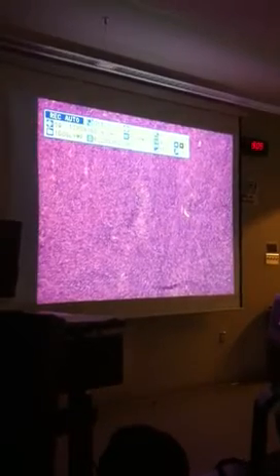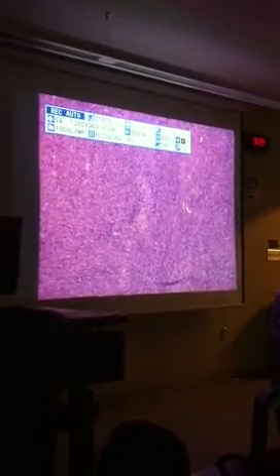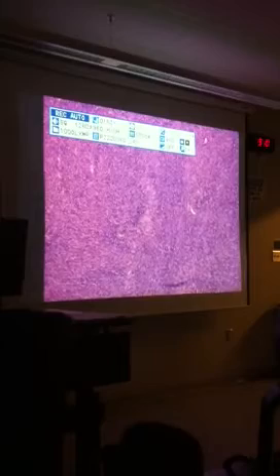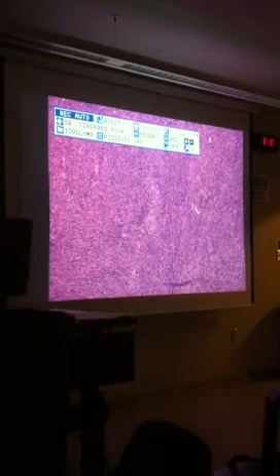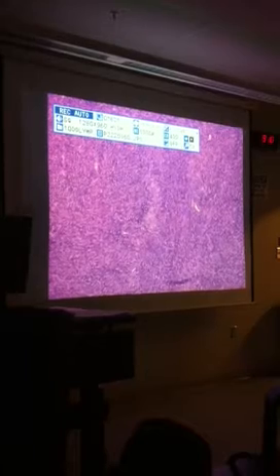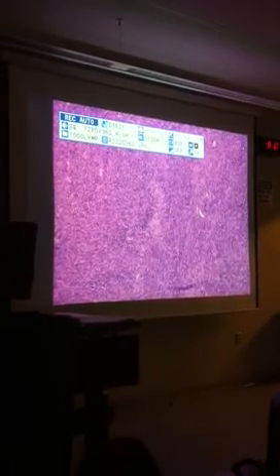So those are the only two parts of the uterus that I would expect you to know for histology. The endometrium, and then the majority of it would be the myometrium, the smooth muscle. And then again, way at the bottom, you'll have connective tissue that surrounds the organ. That's the serosa or perimetrium. I'm not going to ask you that because it's just not that interesting for histology. Okay. All right. I hope that helps.